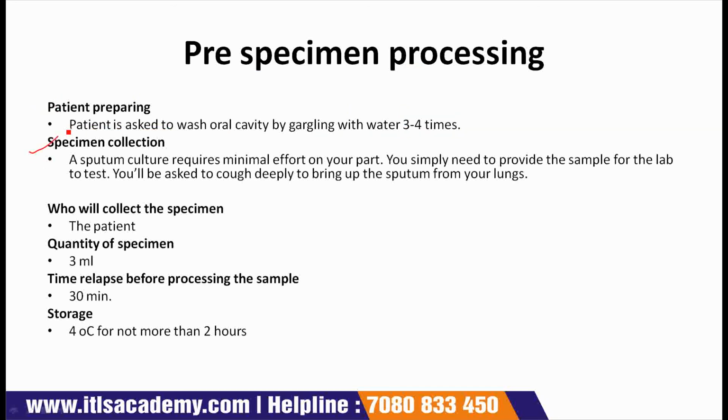Next one comes is specimen collection. A sputum culture requires minimal effort on your part. You simply need to provide the sample for the lab to test. You will be asked to cough deeply to bring up the sputum from your lungs.